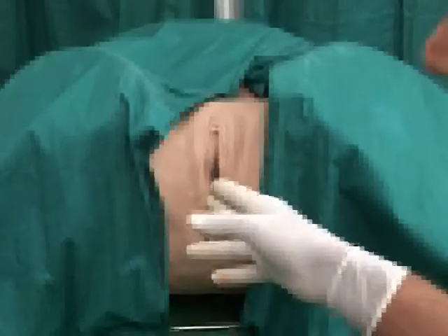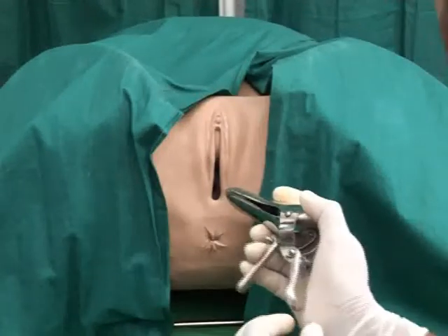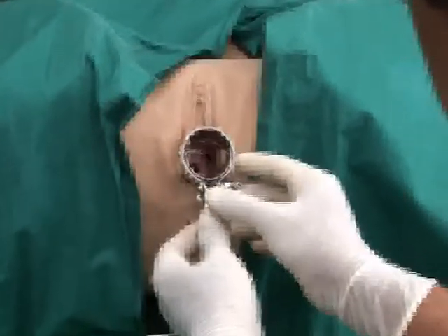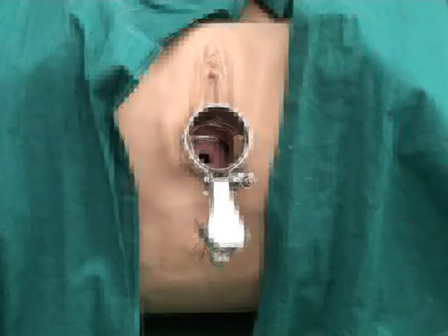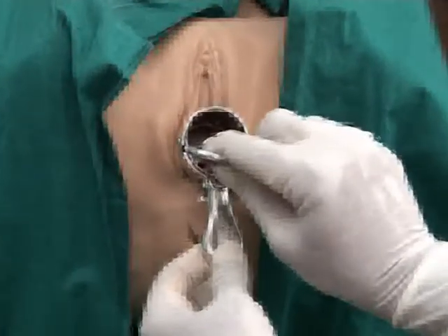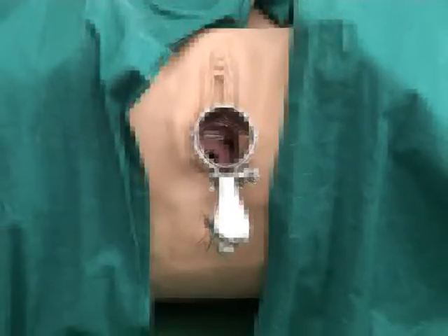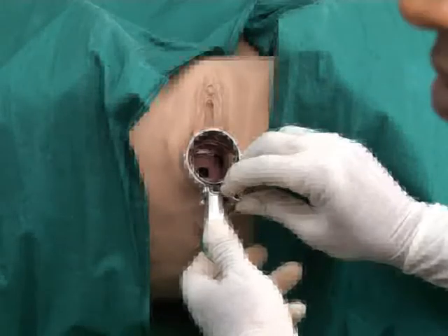The next step is to do a speculum examination using the Cusco's bivalve speculum. Once you see the cervix, you need to clean the cervix with antiseptic solution, since during this procedure all precautions should be taken to maintain sterility. Next, I will demonstrate the rest of the procedure using the model.